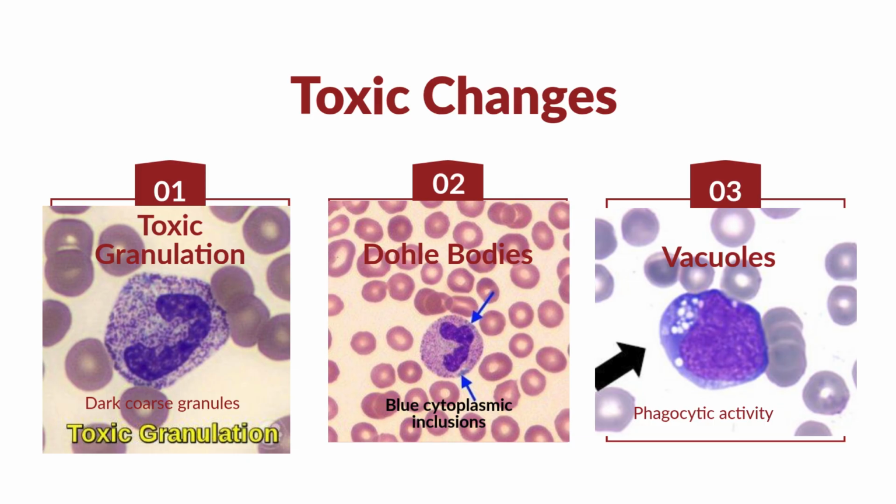And why would we see cytoplasmic vacuoles like we see here in this cell? You can see those clear holes or spaces in the cytoplasm. Those are vacuoles. And these should not be in other cells because this is active phagocytosis. The neutrophil is actively eating bacteria or debris.